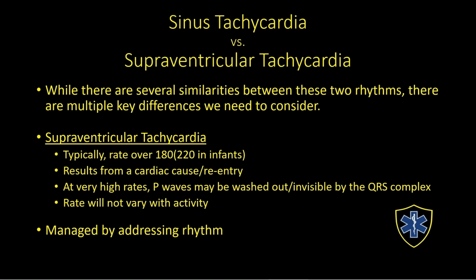Her story didn't yield anything as far as sickness or other issue or reason she'd be compensating, but eventually cardiology placed her on a Holter monitor. She was discharged home, and sometime later was diagnosed with PSVT when the at-home Holter monitor caught 2 or 3 of these runs and was able to actually show what was going on.